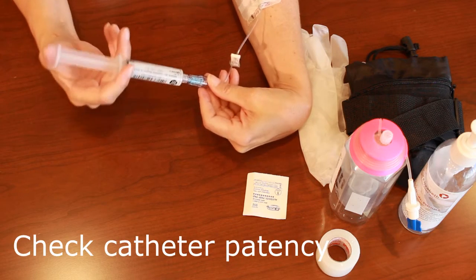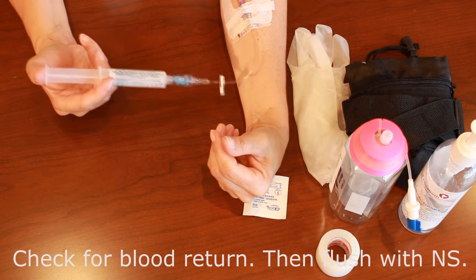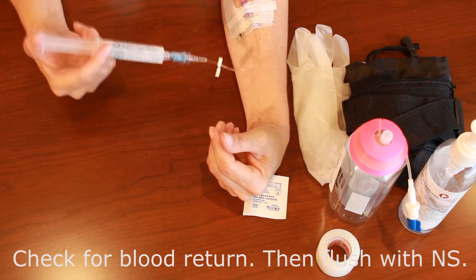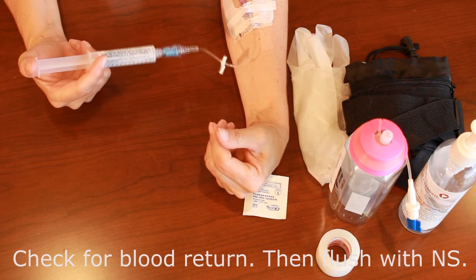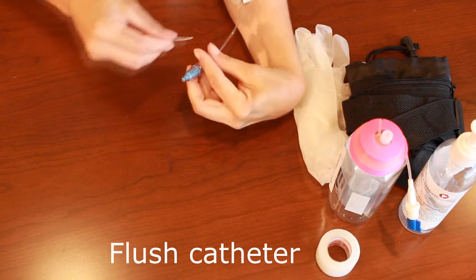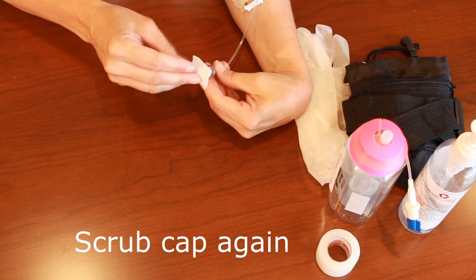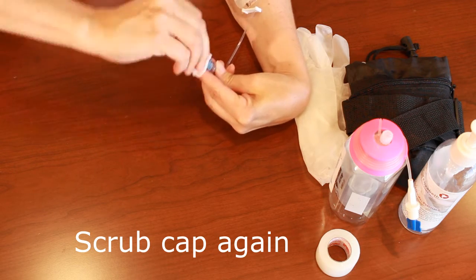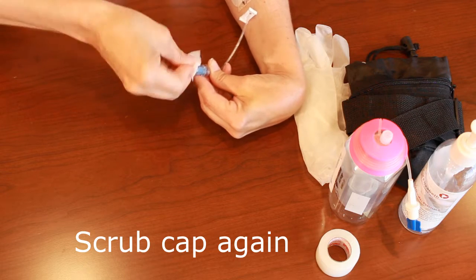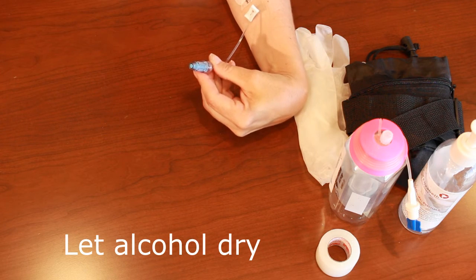Flush your catheter as per your protocol, pushing on the plunger of the syringe. As you're pushing, assess how easily the fluid is going in — resistance can be an indicator of blockage in the catheter. You need to ensure that you have a patent catheter where your solution will flow easily. With another alcohol swab, scrub the cap once again with friction for at least 15 seconds to ensure there are no microbes on the end of the cap, as any present would be infused directly into your patient's bloodstream.